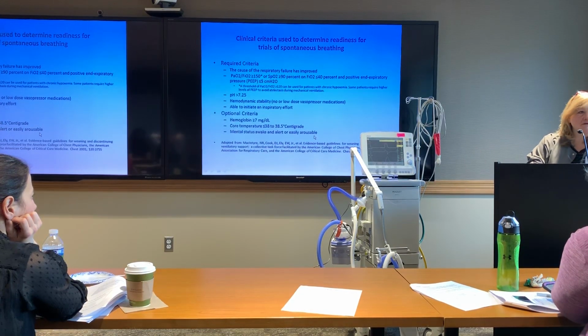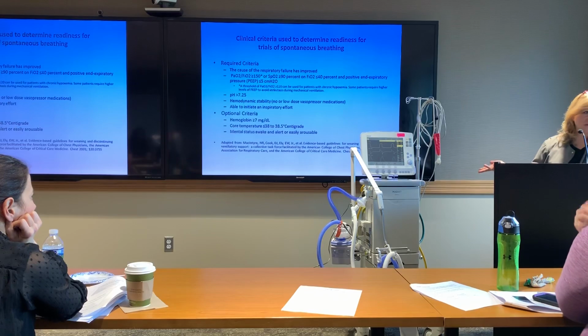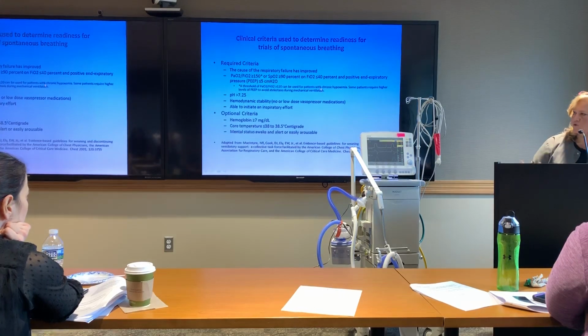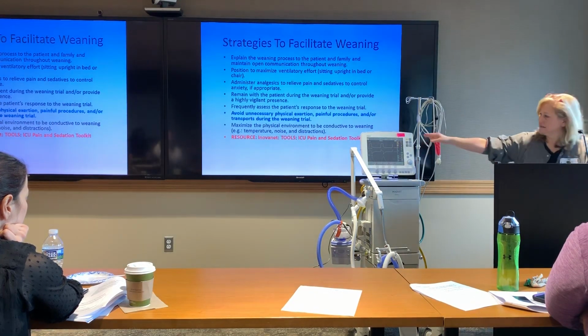Now, obviously, in your unit, we do spontaneous breathing trials on people who have intact drives but aren't arousable, because we want to see if we just need to trach them or whatever. So that's obviously something that we do that would be different, and correctly so. But there's so much stuff on weaning out there, you could just drive yourself crazy. Just don't read anything later than 2005.